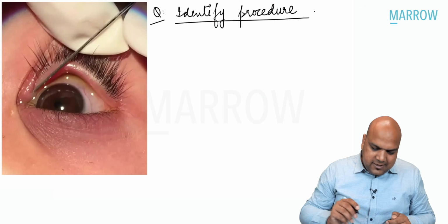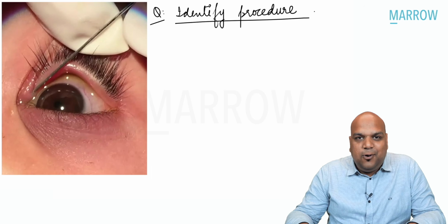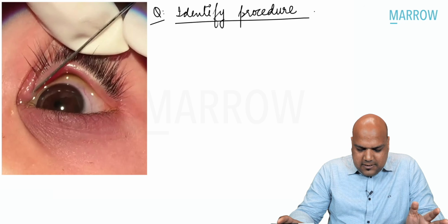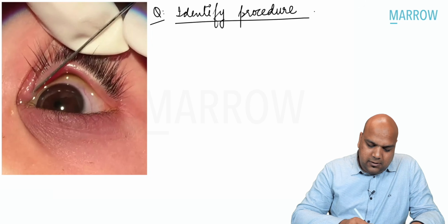Now, moving on to the next image, everyone identify which procedure is being done. Such images have been given a lot of times in the examination, and a lot of students say a lot of weird stuff about this. This is a pretty simple thing. People who know the answer, yes, you are commenting, I hope. But let's see what is being done.